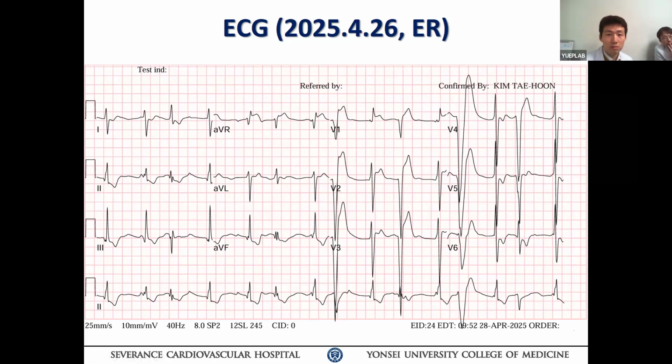What is the cause of AV dissociation? Is it due to ventricular rhythm predominance or a block? If the PP interval is shorter than the RR interval, probably it is a block, right? But the PP interval is longer than the RR interval. It could be the ventricular rhythm. Am I right? Yeah, but the PP interval is not regular. Yeah, that's right. There is no more V than A, so I think it is not a block. But yeah, not isorhythmic, not complete AV block, but AV dissociation.